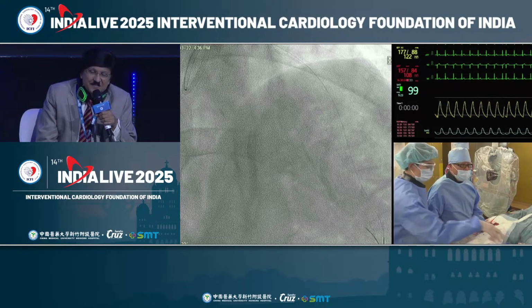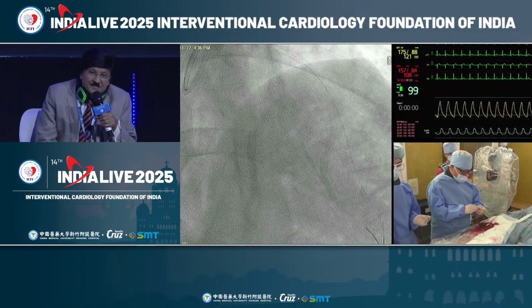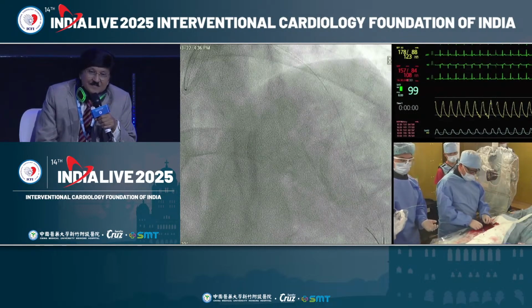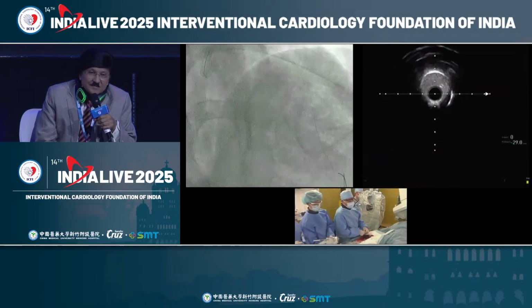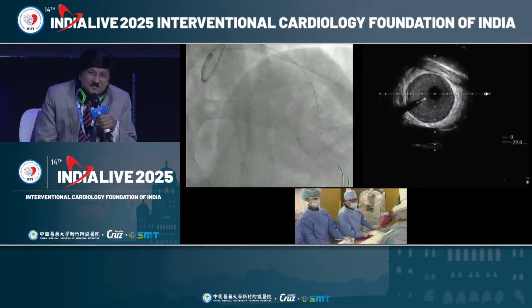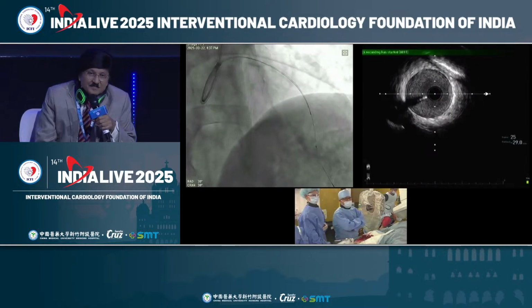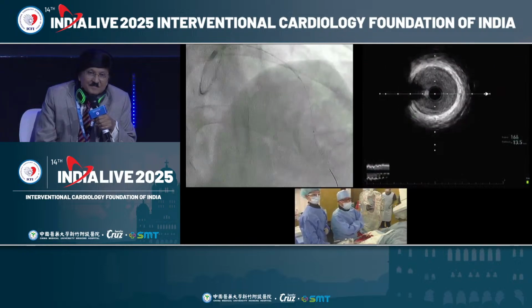Of course I know OCT shows us the thickness of calcium, but thickness is not always hardness, because calcification always has different components and different density. So sometimes OCT and CT tell a lie. I always use IVUS because I want to check how to rotablate and how to crack during the procedure. IVUS can show us findings many times.